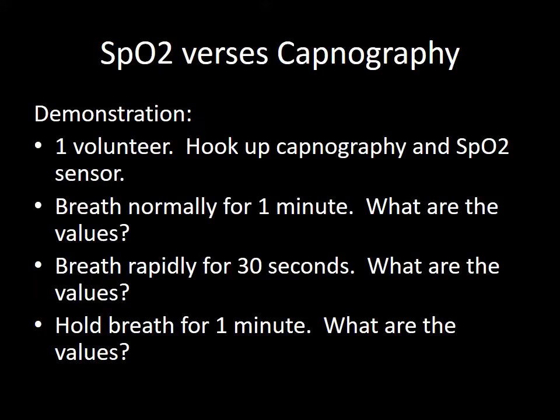And by the way, I would wait until after you've hyperventilated. I would wait about 5 or 10 minutes before you do the hold-your-breath part, or you're just going to be back to normal. So hold your breath for 1 minute after you've waited about 5 minutes, and the next breath is going to be very high in carbon dioxide. But what's going to happen to your SpO2, and that's really the big value of capnography.